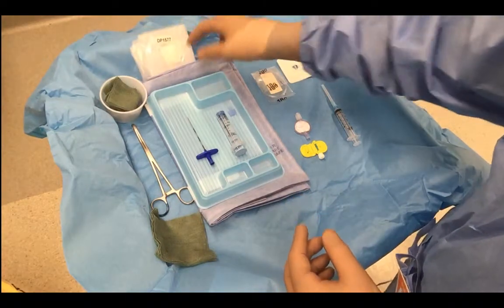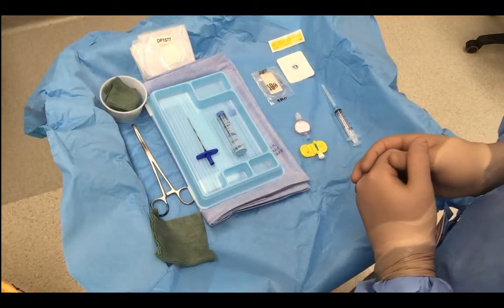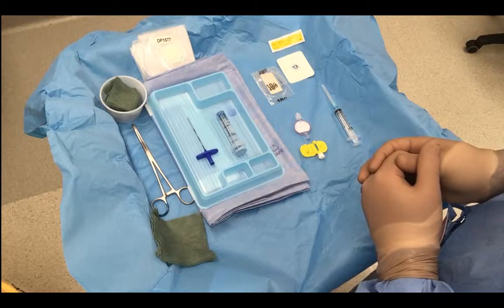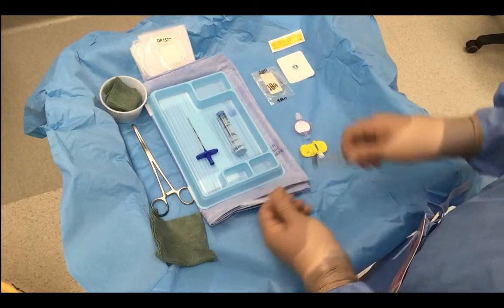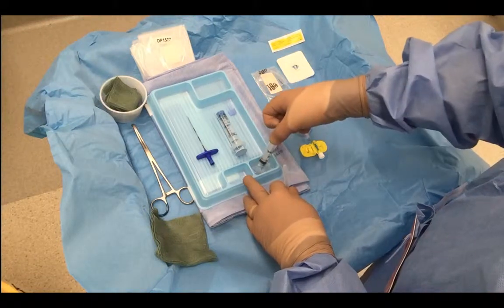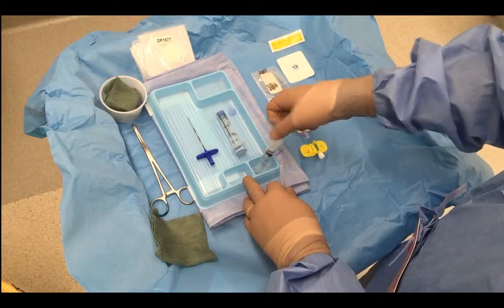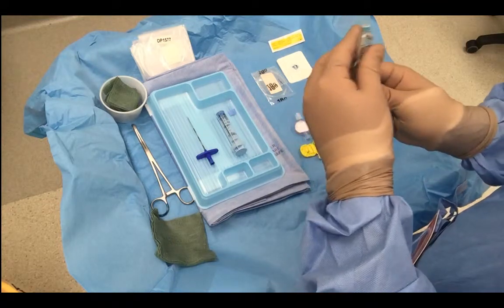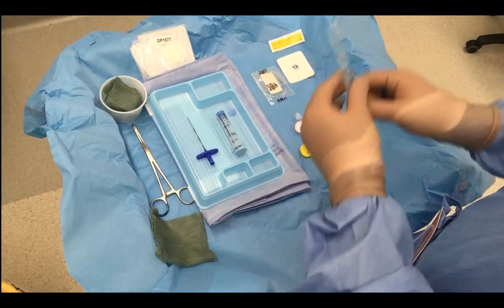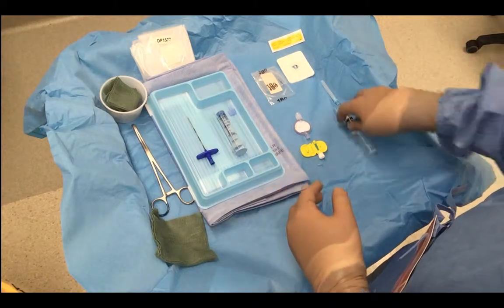We've got two different kinds of drapes depending on how you would like to drape your patient. So, just in terms of our prep, I've got 1% xylocaine, whatever your skin prep of choice is, we're going to draw up and have ready for our patient. So that's local anaesthetic for the skin, the blue needle, easily identifiable, there's nothing else in a 5mL syringe. Okay, that's off to the side.